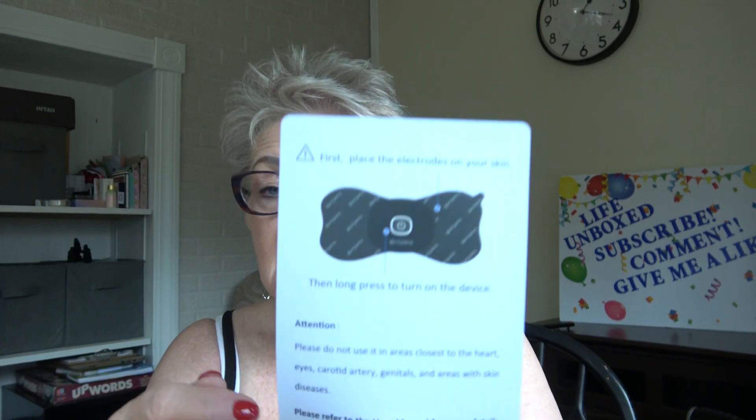So, first off — place the electrodes on your skin, those are what the electrodes look like. Then long-press the little blue button to turn on the device. Please do not use it on areas closest to the heart, eyes, carotid artery, genitals, or areas with skin diseases. Please refer to the user manual for more details.